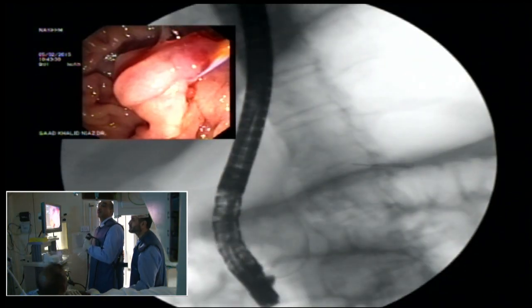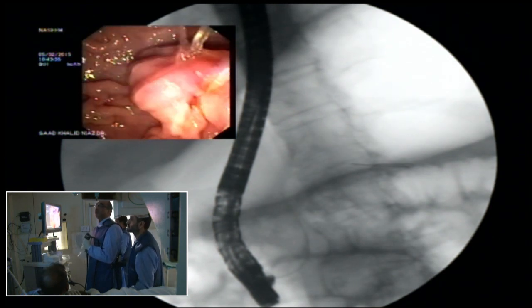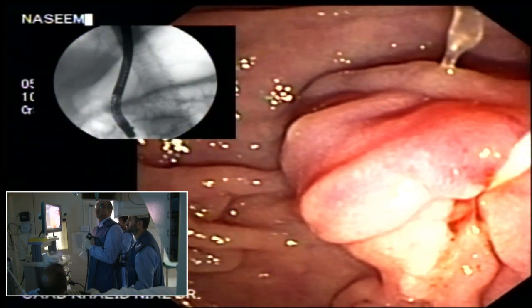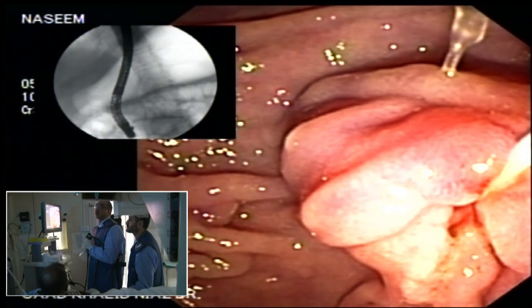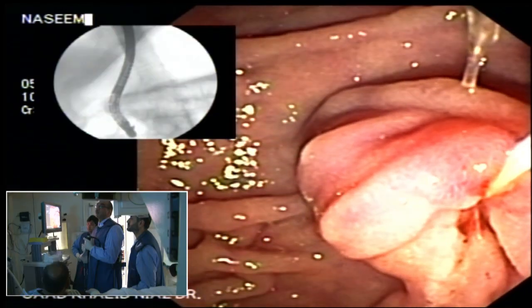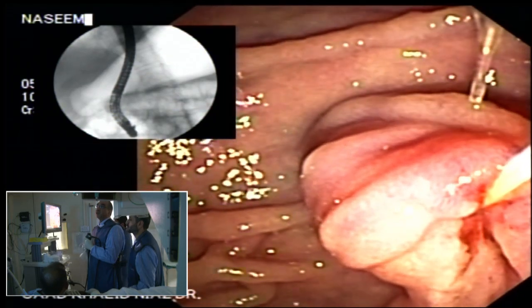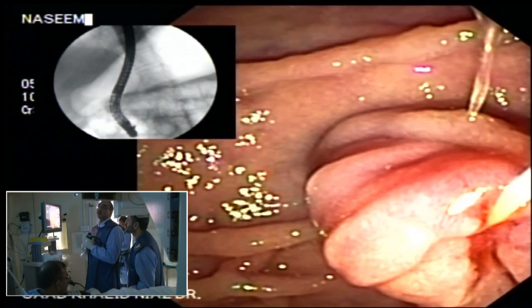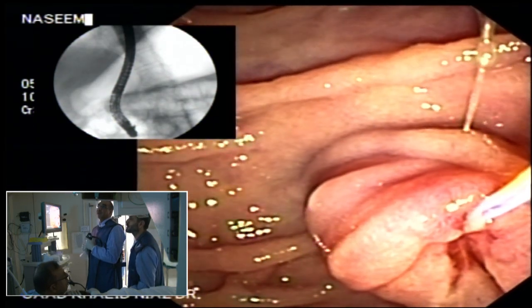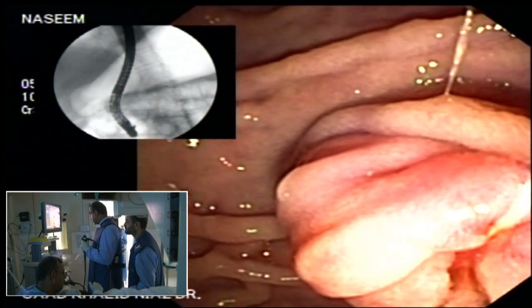Yes, Khalid. Sorry, Waqar. Yes, sir. It's just that Kamran has raised the issue that, would I do a double wire technique or use a stent in? I mean, sometimes it's quite acceptable just to leave the wire in the pancreatic duct and keep attempting the CBD. And then you can put a stent in the pancreatic duct at the end of the procedure. That's pretty safe and useful. Usually the advantage is that the stent doesn't interfere with your cannulation. I think sometimes if the stent is getting in the way, then it might be a problem. I think you're totally correct.